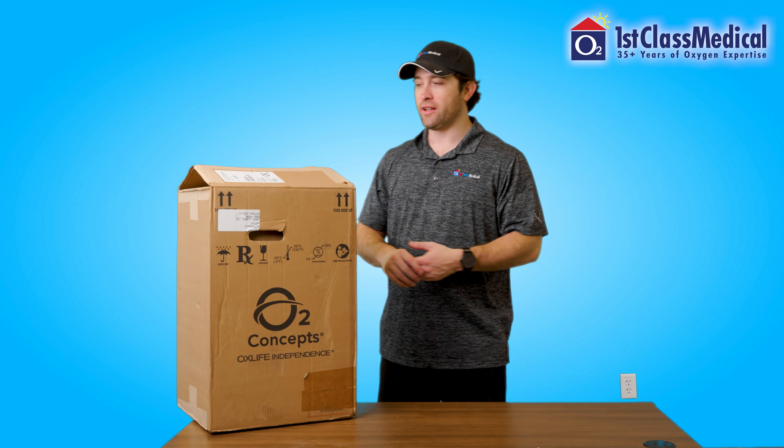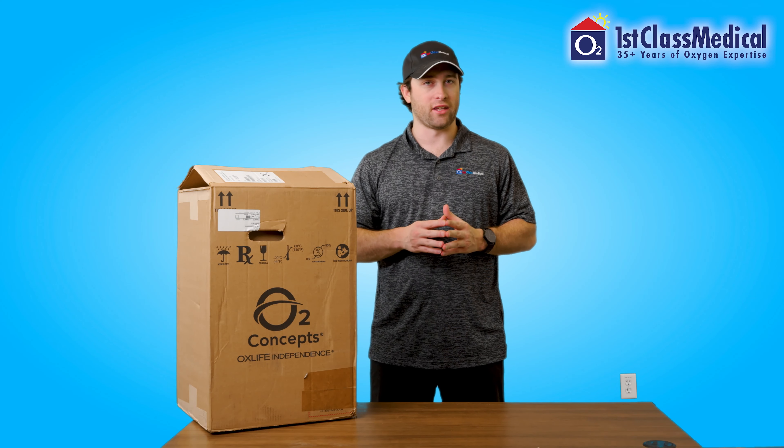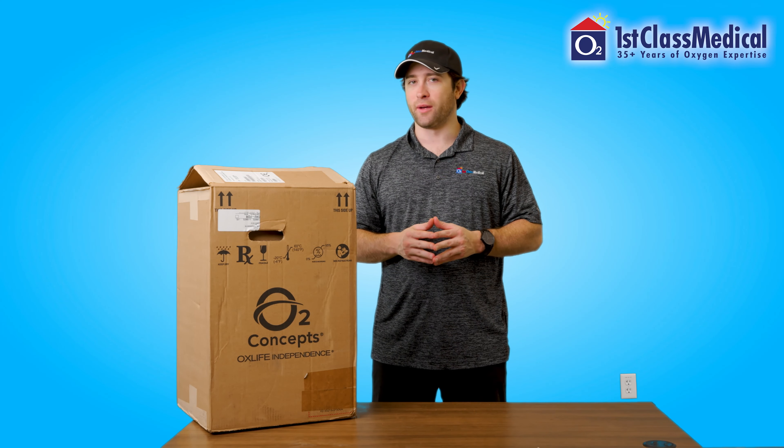To start off, we're going to take all the items out of the O2 Concepts OxLife Independence packaging here to show you what you should expect when you receive yours.